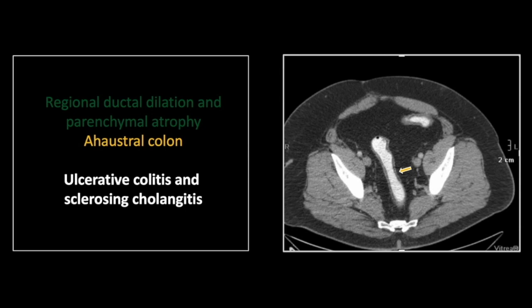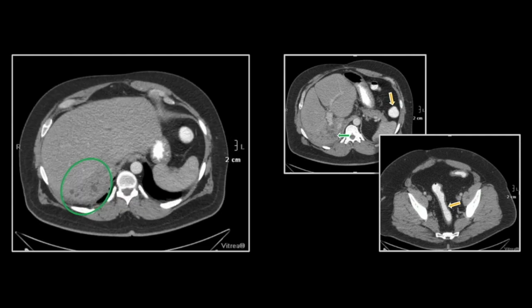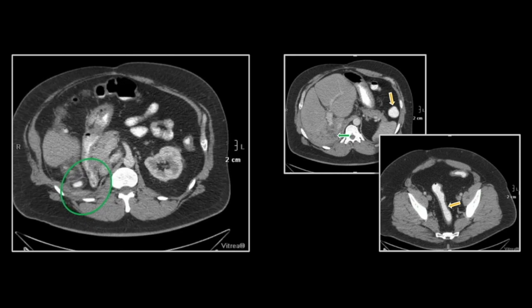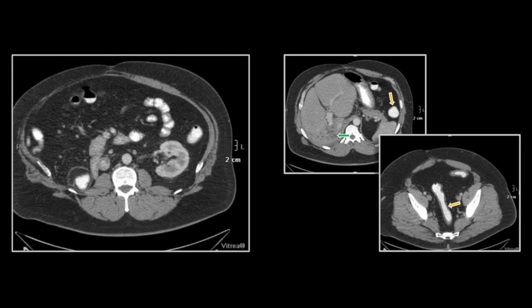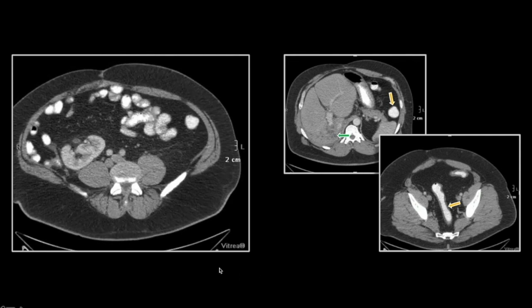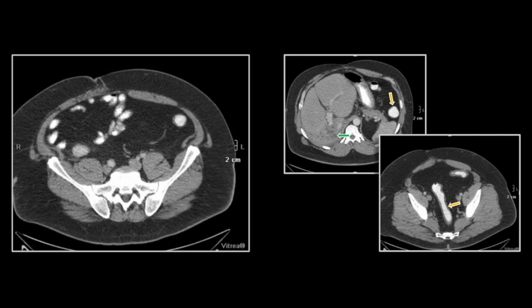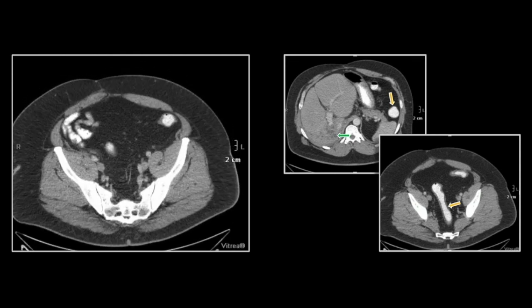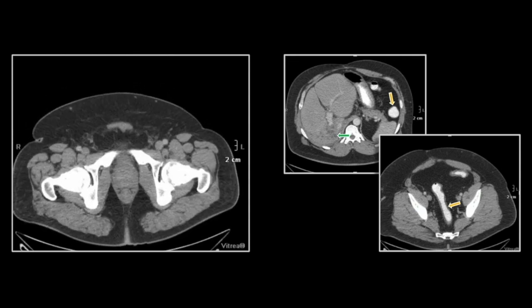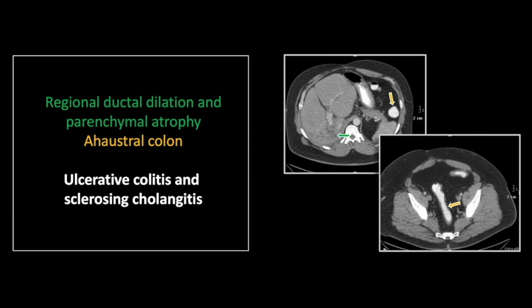Here again you see the hypodense featureless colonic wall involving the entirety of the colon. Note the parenchymal atrophy and the approximation of dilated ducts. Obviously there is evidence as well of a prior hepatic resection. Note the featureless colon with regions of hypodense bowel wall all throughout the entirety of the colon, involving even the sigmoid and rectum. Pretty much classic chronic ulcerative colitis findings and the classic appearance of its associated sclerosing cholangitis.